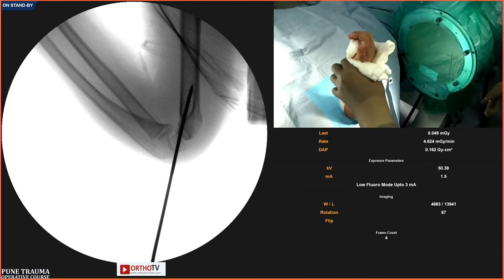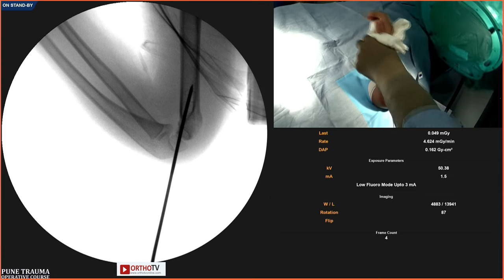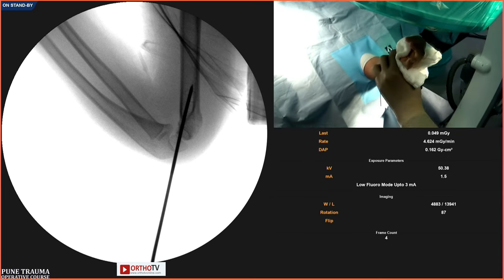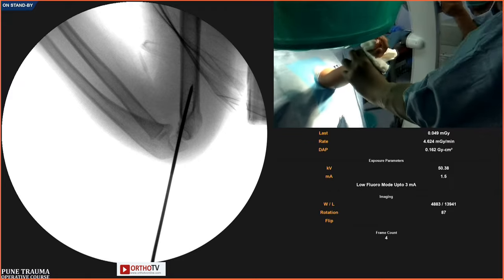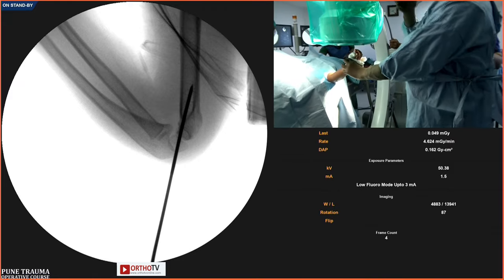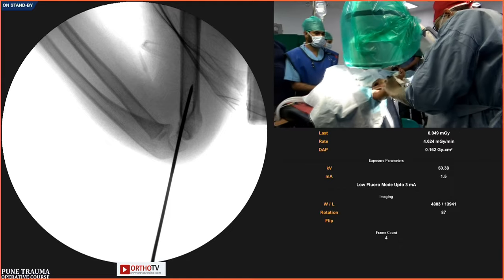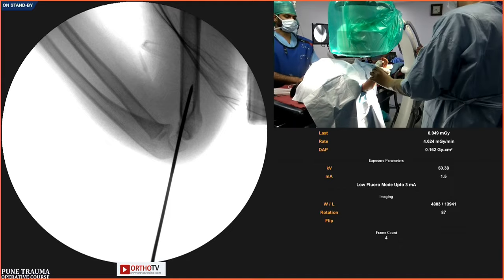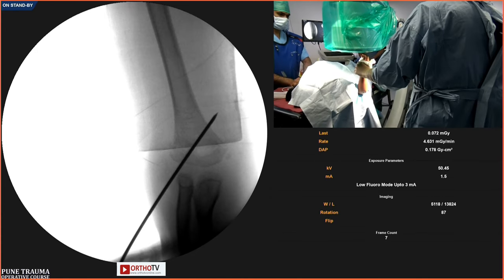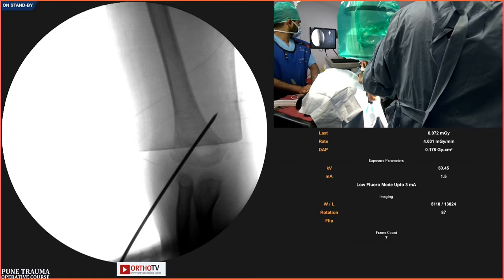Sandeep, just a minute, I want to show the audience a new sign which has been described, which is this hourglass sign. Can you see this hourglass? If you see this hourglass, it means your reduction is perfect. You must see this hourglass on a lateral view. Where is it? This is one upper U of the hourglass and this becomes the lower U of the hourglass. Taral, can you see that pin now? That is the fossa pin. We can see it in the AP, right.